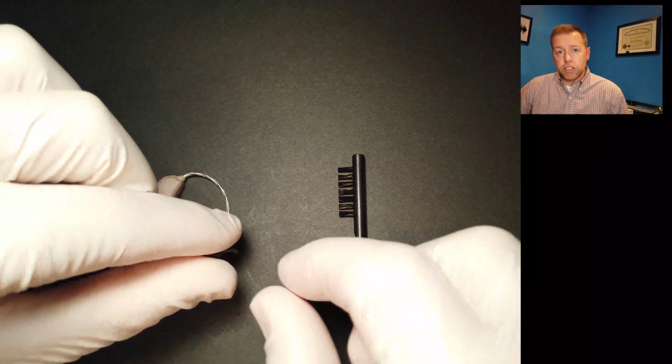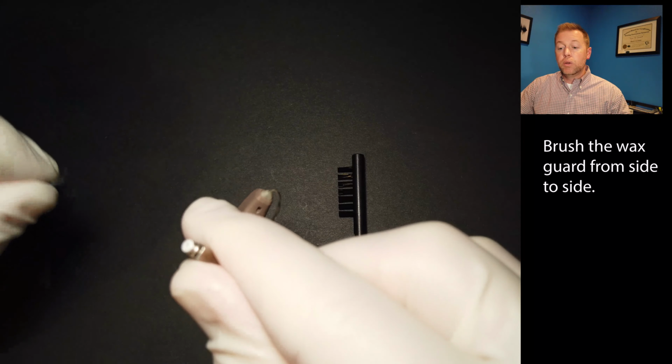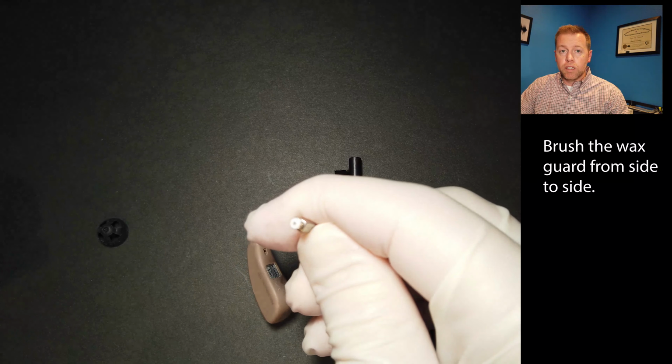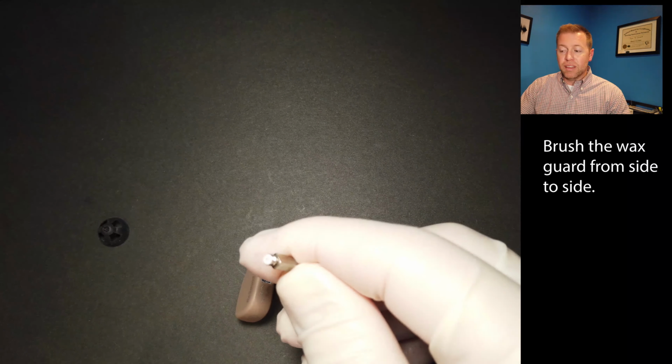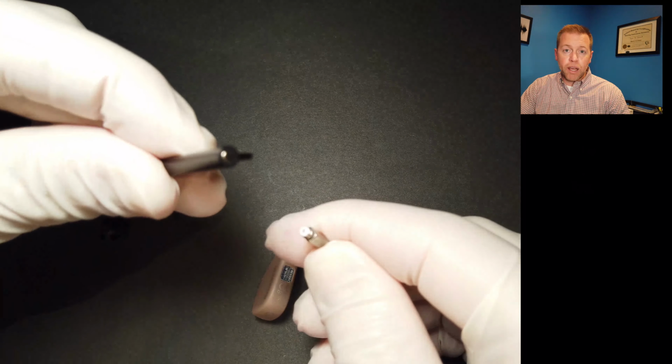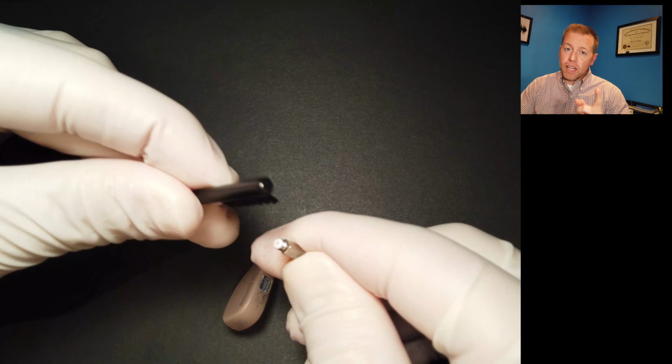Okay, before we start changing the wax filter, a lot of people are still afraid to do this. So you can just take off the dome of the hearing aid and take your brush and brush off the filter. That will clear any kind of wax or debris out of there. Sometimes it's best to just change the wax filter anyway, and that's what we'll do next.